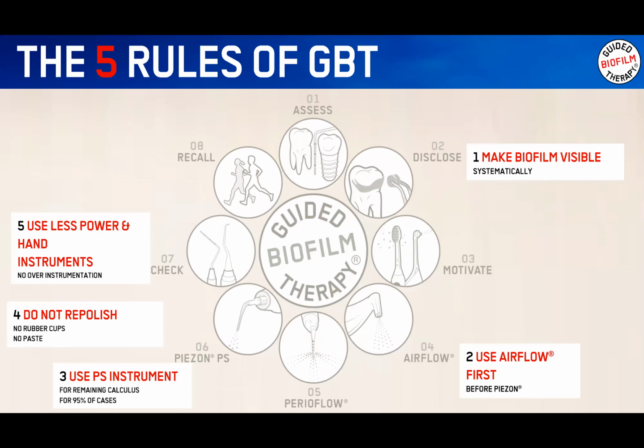The 5 golden rules of GBT: every single time make biofilm visible for us, but also for the patient. We start by using the airflow. First, we use the PS instrument in 95% of the cases. We do not repolish, no rubber cups, no prophy paste, and we are using less power and hand instruments as possible. So we are not over-instrumenting the patient.